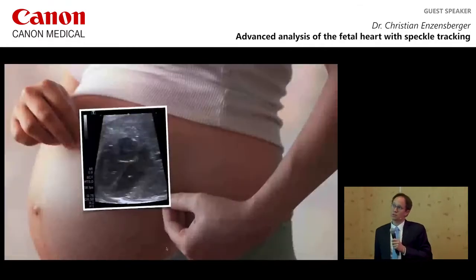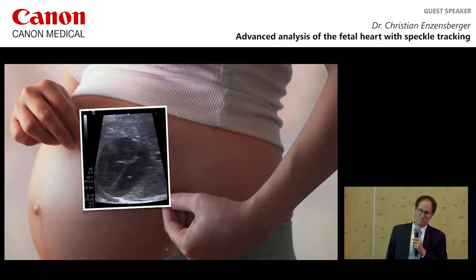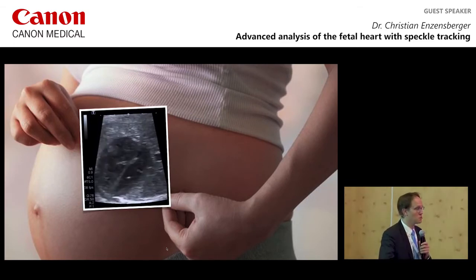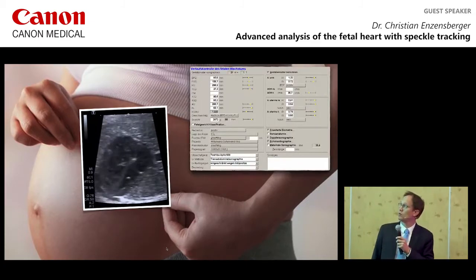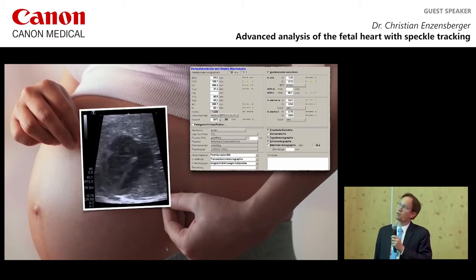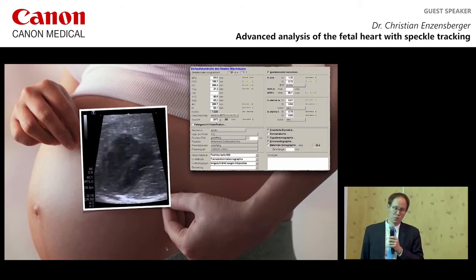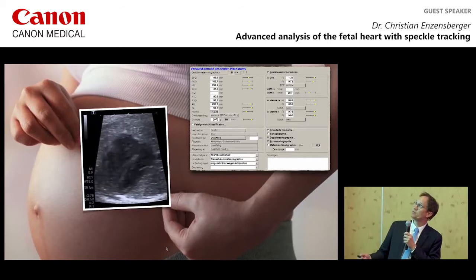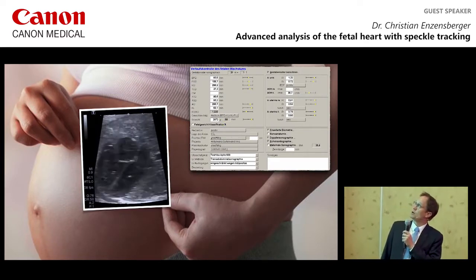I would like to start with this clip of a fetal heart. It's a normal fetal heart, you have to believe me. It's a normal fetal heart of an obese mother, BMI 35.4. The mother has gestational diabetes and is at 32 weeks of gestation. Now, fetal biometry: you can see the estimated fetal weight here is 88th centile, with normal fetal Doppler parameters.